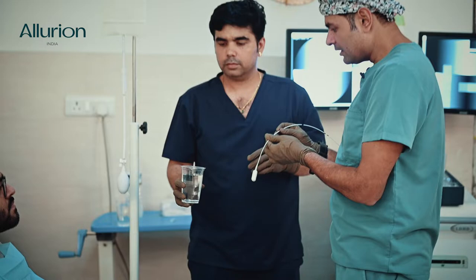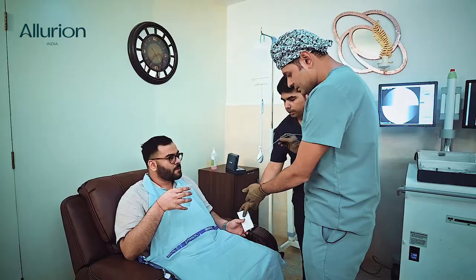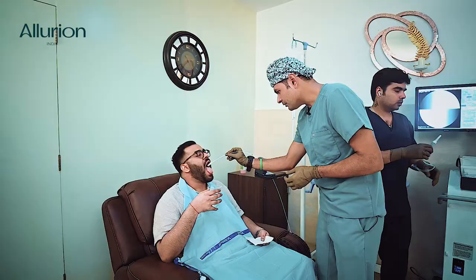Now you can hold this glass of water in your hands and take some sips of water so that your mouth is completely wet. Pull a tissue paper with you so that in case you spit or want to clean your mouth you can do that. Once I put this inside, just take a continuous gulp of water and keep drinking — I'll assist you with the stilet.